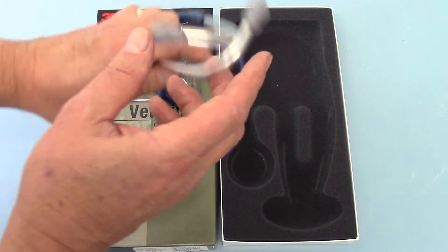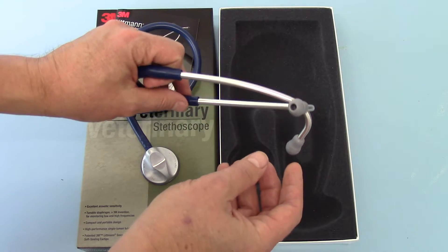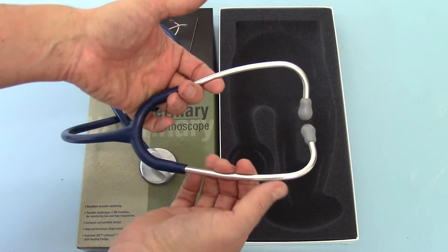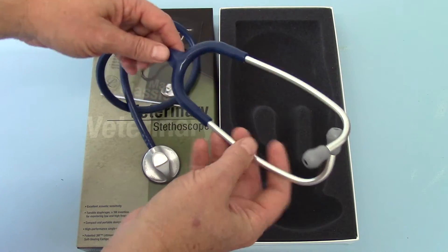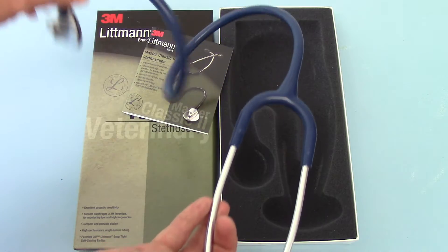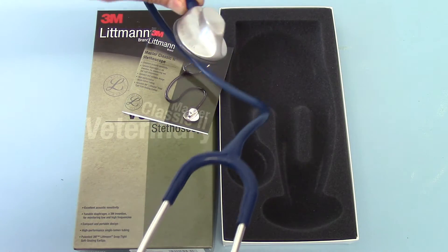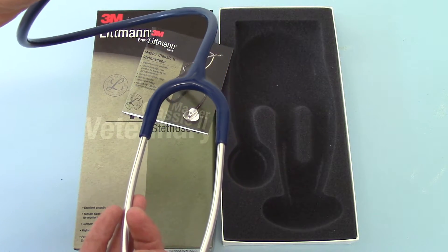It doesn't come with any spares, which can be a little disappointing, seeing as the medical versions do. But you get soft ear tips fitted and a standard sprung size headset, which is quite comfortable to use. The difference here is you get a slightly elongated tube with a decent sized lumen, so the auscultation with this is very, very good.